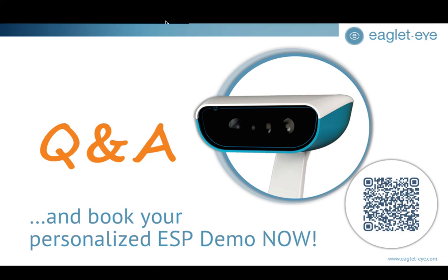Yeah, so dry eye absolutely can impact it for sure. But that's true with any topographer; dry eye and ocular surface can impact any measurements that we take in the clinic that measure the anterior eye. There are very, very few patients that we cannot get a scan on because of dry eye, because of the hydration step at the beginning. And in those cases, with patients with really dry eye that are very sensitive to holding the eyes open, we do sometimes use a numbing agent as well.